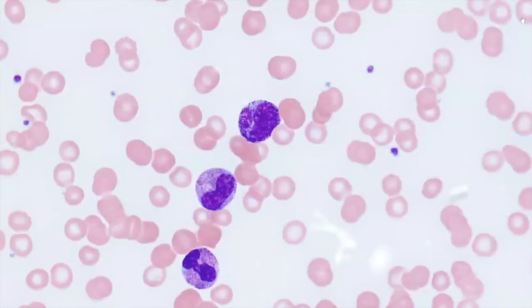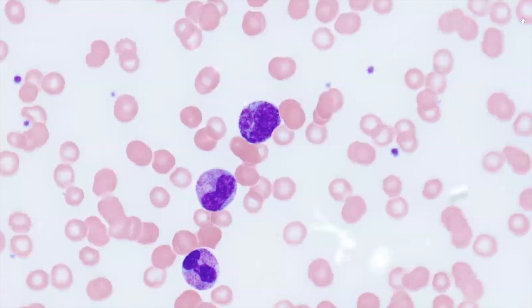The toxic granulation, compared to the fine light purple granules of normal neutrophils, toxic granules in neutrophils are larger and stain a more purple or dark blue. They resemble primary or azurophilic granules typically seen in promyelocytes. Toxic granules can be seen in some or all of the neutrophils and is associated with a variety of clinical conditions including severe infections, burns, trauma, and G-CSF.